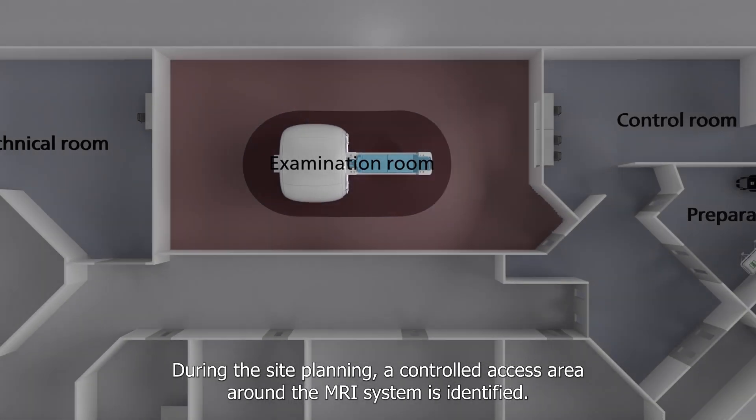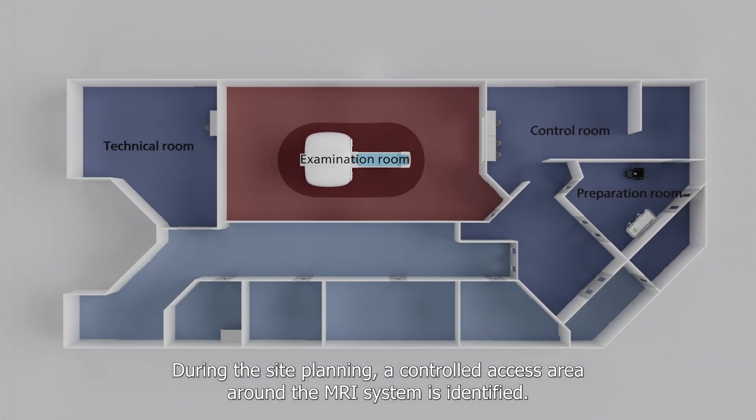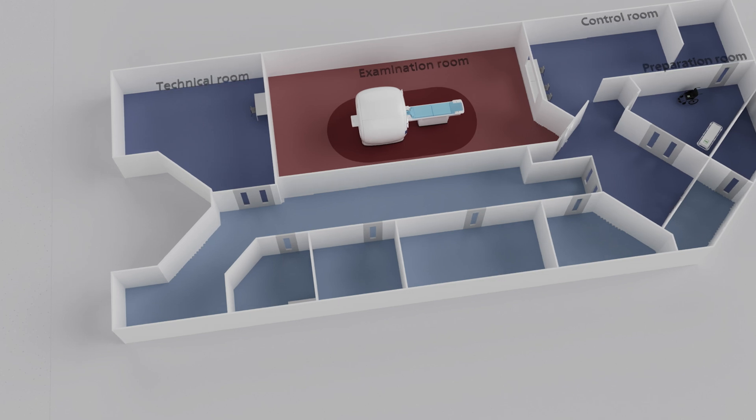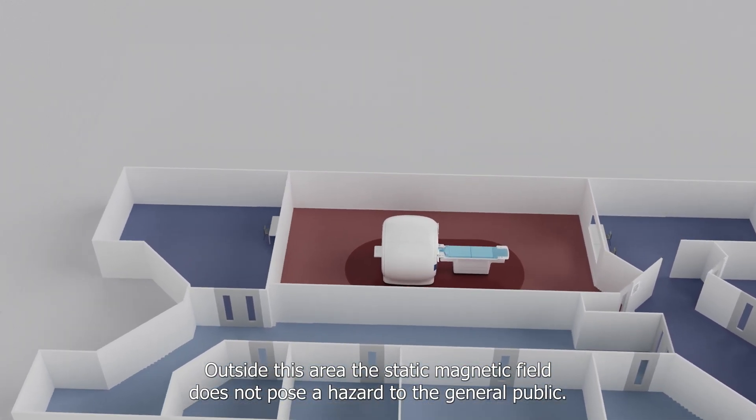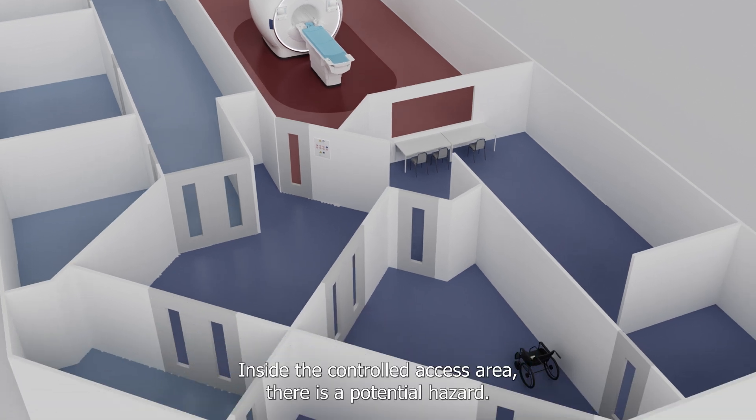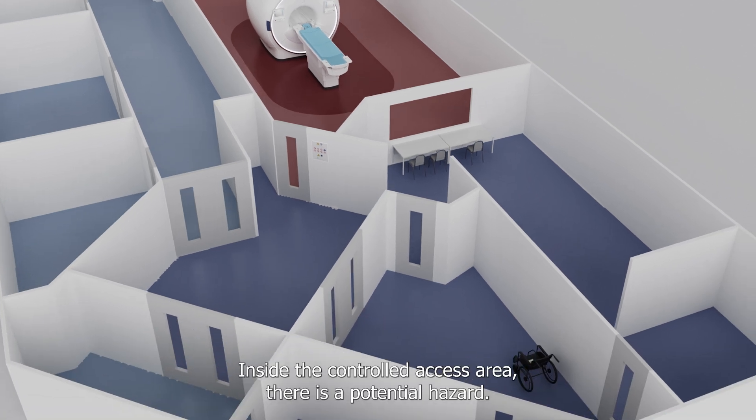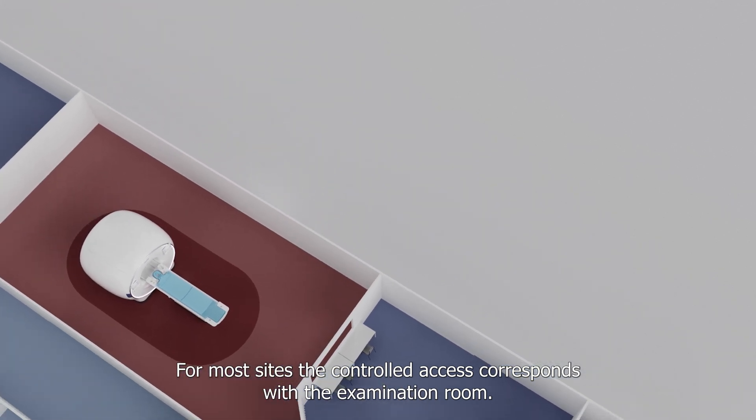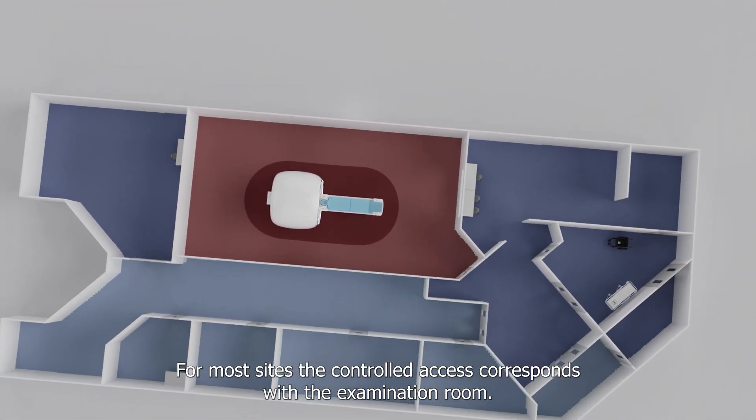During site planning, a controlled access area around the MRI system is identified. Outside this area, the static magnetic field does not pose a hazard to the general public. Inside the controlled access area, there is a potential hazard. For most sites, the controlled access corresponds with the examination room.